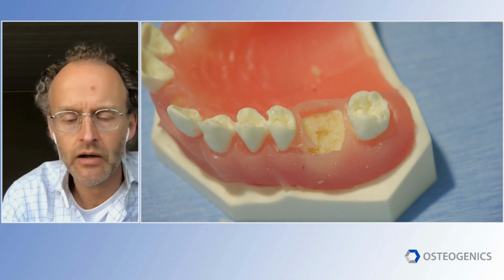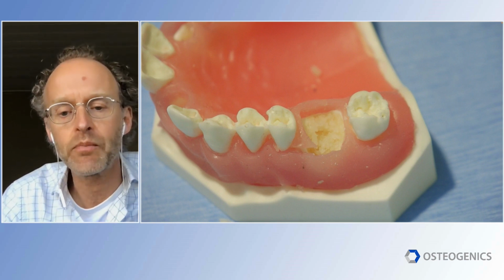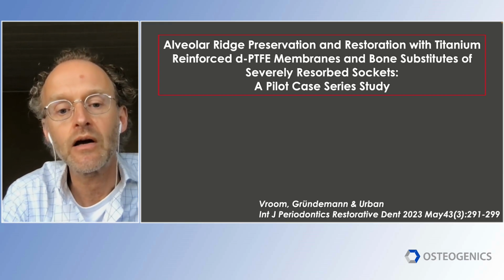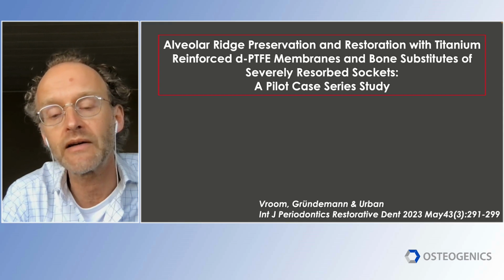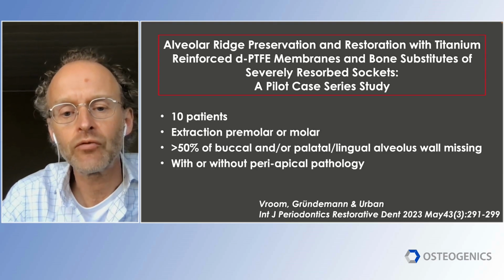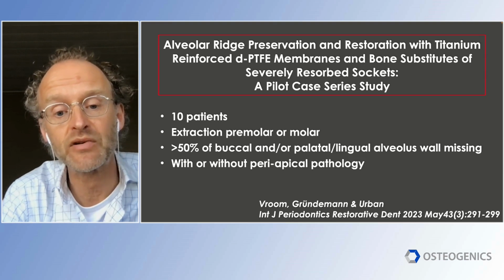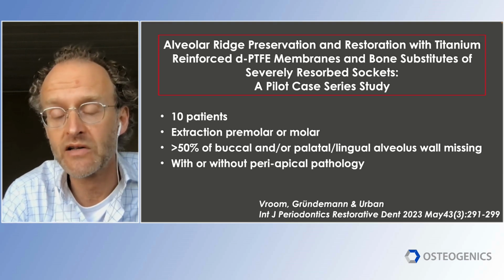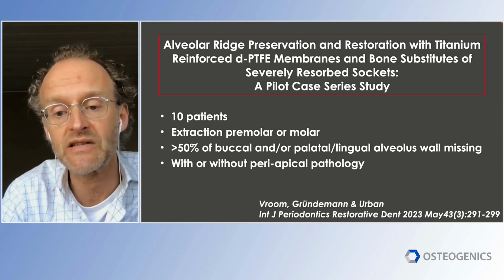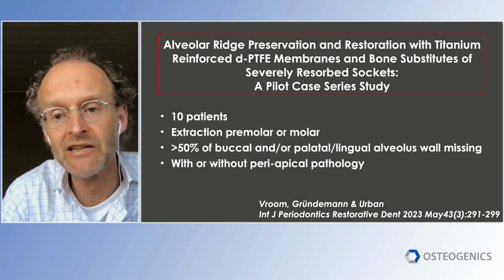And because we were having such a nice result with also the severely resorbed cases, we wanted to report on this. And that's why we conducted a pilot case series study, which I conducted with Lodewijk Grundemann and Is van Urban. And we included really severe cases, because most studies exclude 50% bone loss or more. And as far as our knowledge goes, studies which have been done on ridge preservation with d-PTFE membranes, this is the first one to report on titanium reinforced version.